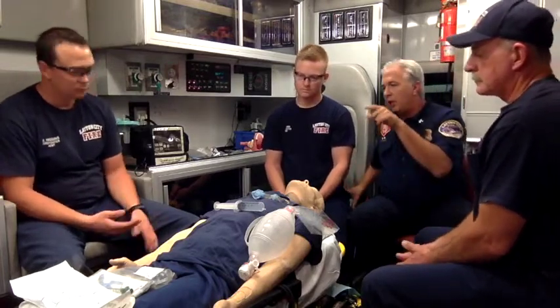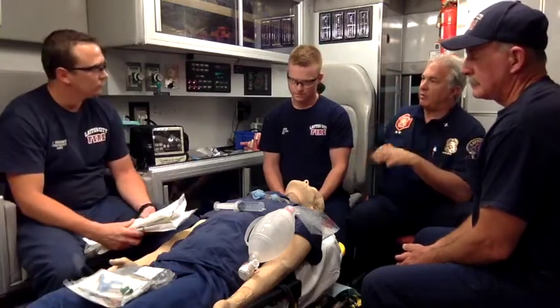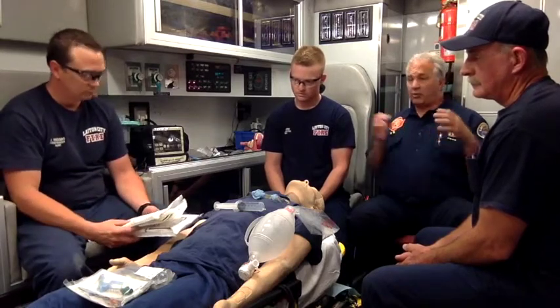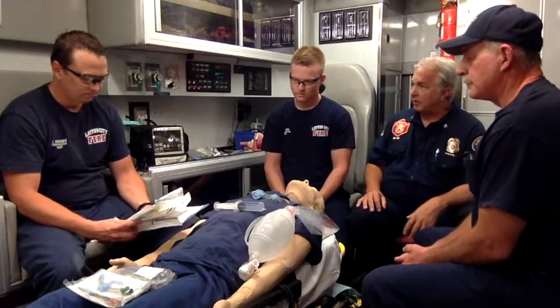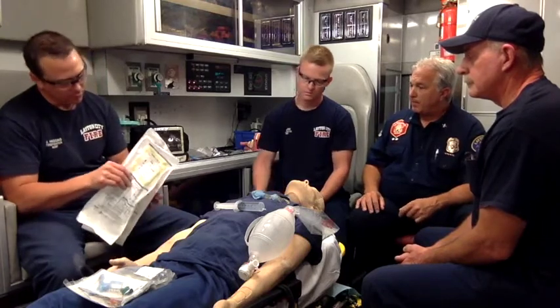And you mentioned already how much air to inflate them with. Now you said it was printed on the package. You and I both know that we have a tendency, as soon as we open a package, especially if my type A self is around, it gets thrown in a garbage can or something like that. So what if I throw that away? Is there anywhere else that I can figure out how much air to use? It's probably printed there on the tube.